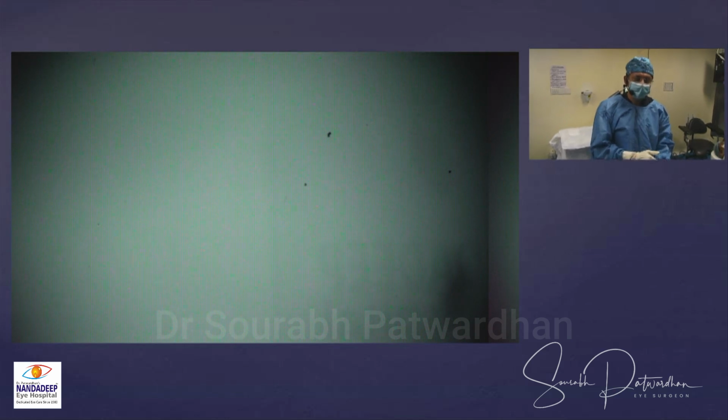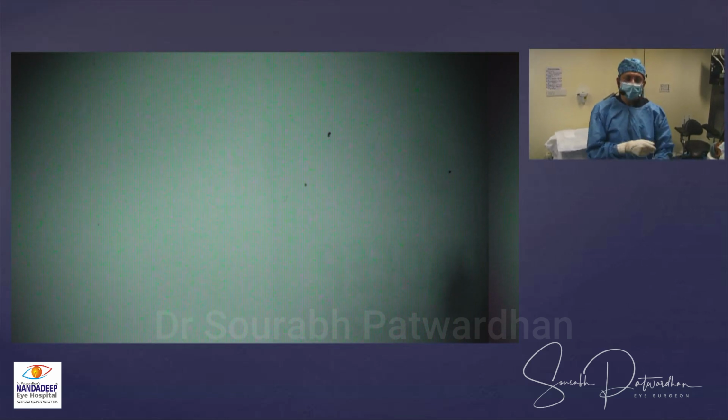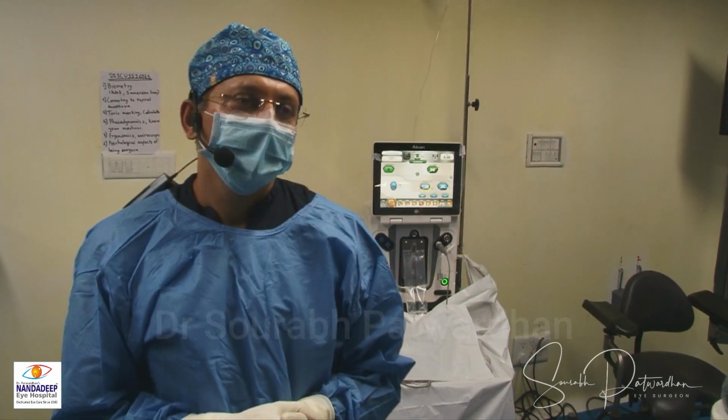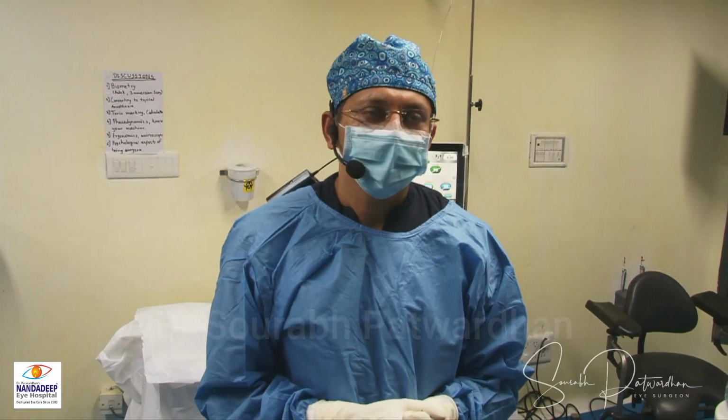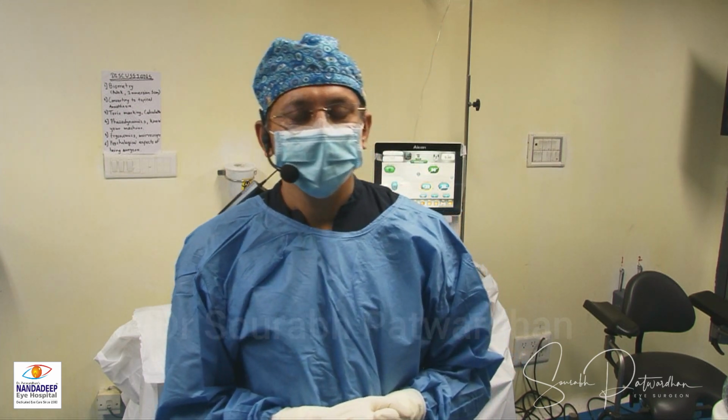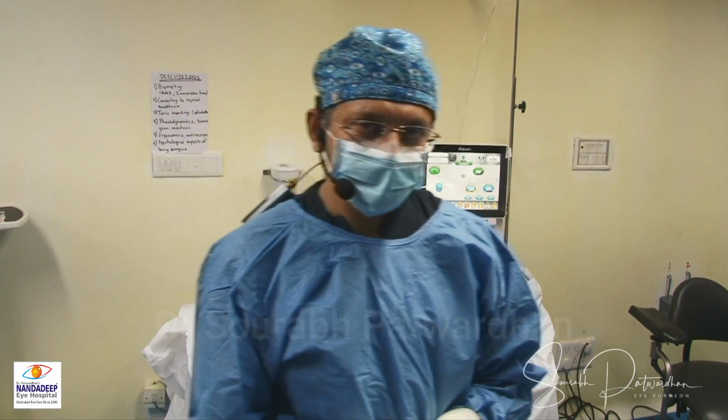Toric IOL, and the patient has astigmatism of around 0.75. The toric selected as per the Barrett TK formula is around 20.5, I think 1.5 cylinder. I'm going to first demonstrate how I use the iToric Android app.